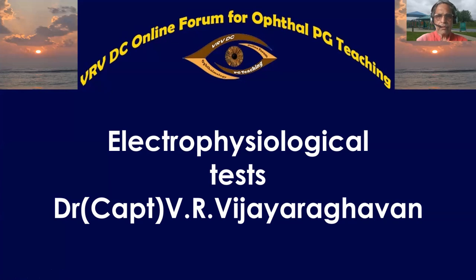My talk today is on electrophysiological tests that can be used to find out the functions of the retina, optic nerve, pathway and all. Suppose a patient has come with some injury in the eye, and you are not able to assess the function of the retina, whether it's working or not. The best option is, of course, ultrasonogram; B-scan and all can help us find out the anatomical status or anatomical integrity of the retina.